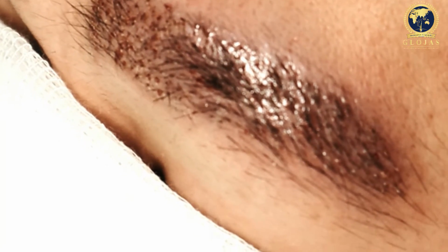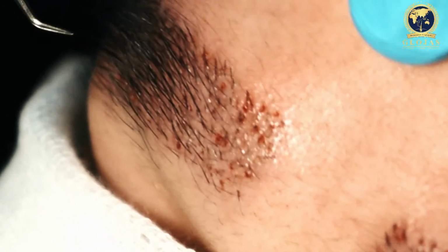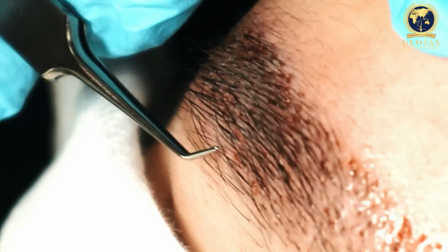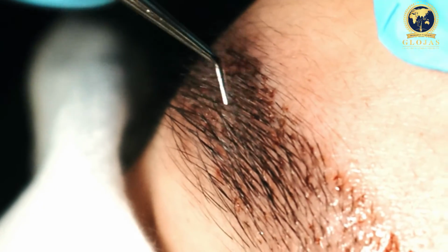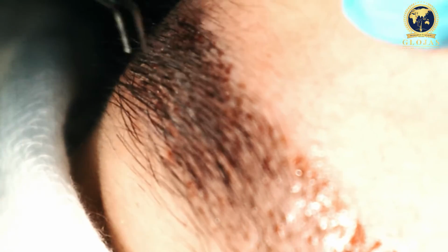Okay, so we have completed the procedure. This is an eyebrow transplant. We have put the graft over here. This is the head of the eyebrow. Then in the middle, we planted the lower part this way, then the upper part this way to follow back again to fill up. Here we increase the density a bit, which follows the normal eyebrow.